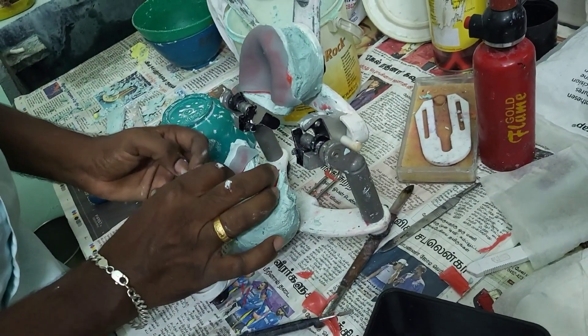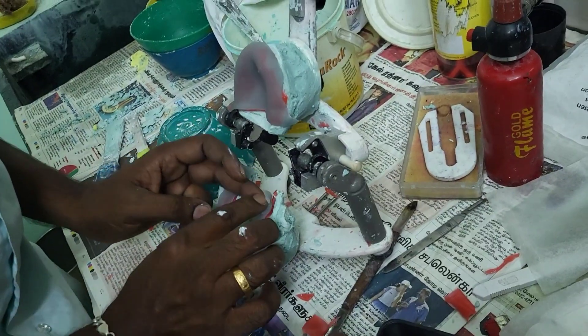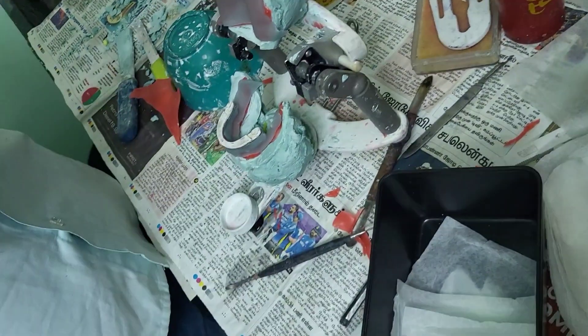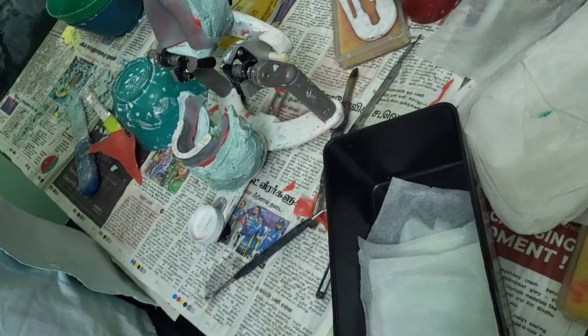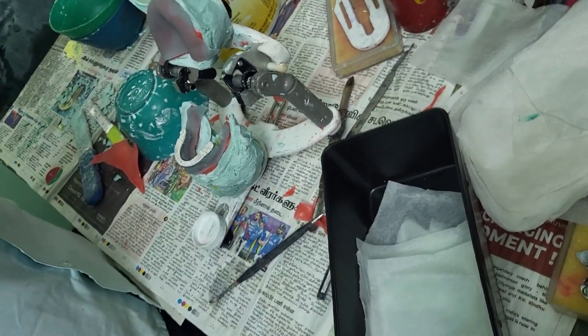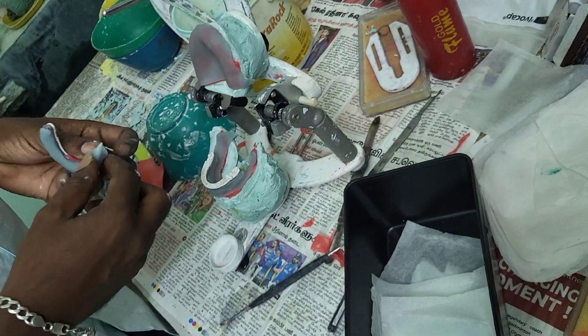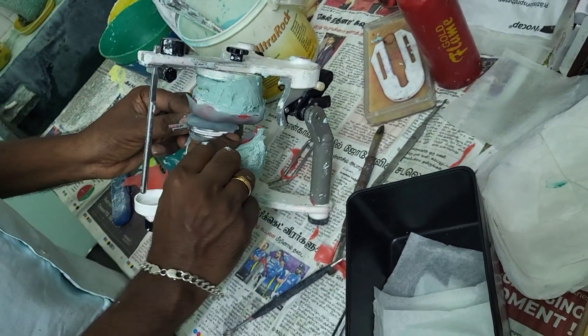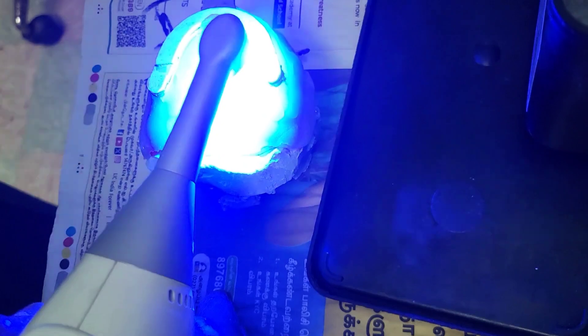In this video I am going to show how border molding is done in a BPS denture fabrication procedure, and simultaneously give the recommended procedure for doing conventional border molding using putty in a single step. We are adapting the gnathometer parts — the centric bearing plate and centric bearing point — on the maxilla and mandible.